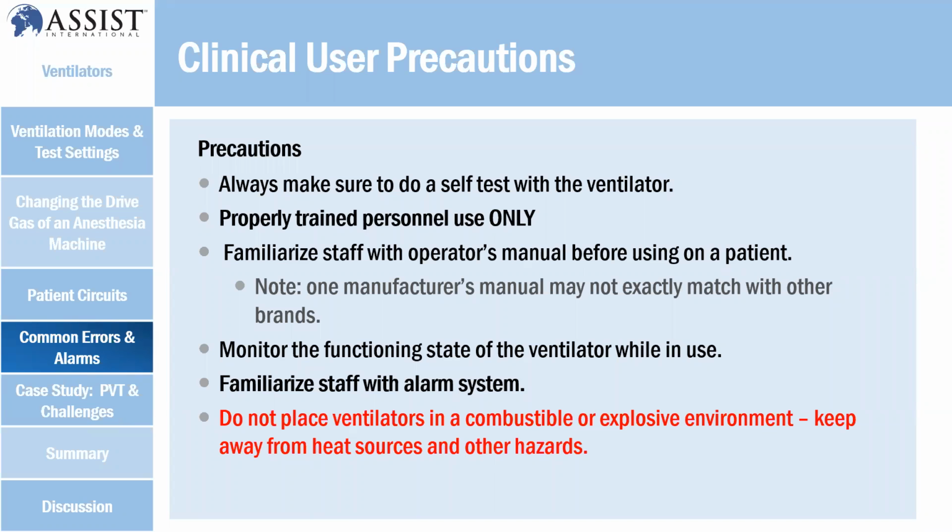Monitor the functional state of the ventilator while in use. Familiarize staff with the alarm system. Always remember, when you get an alarm, always check what the cause of the alarm is. Do not move it as you wish, and do not place the ventilator in unwanted areas, such as near heat, because if you have a cylinder on this device, it can be hazardous, even explosive, because you're dealing with oxygen. So you need to be careful with that.